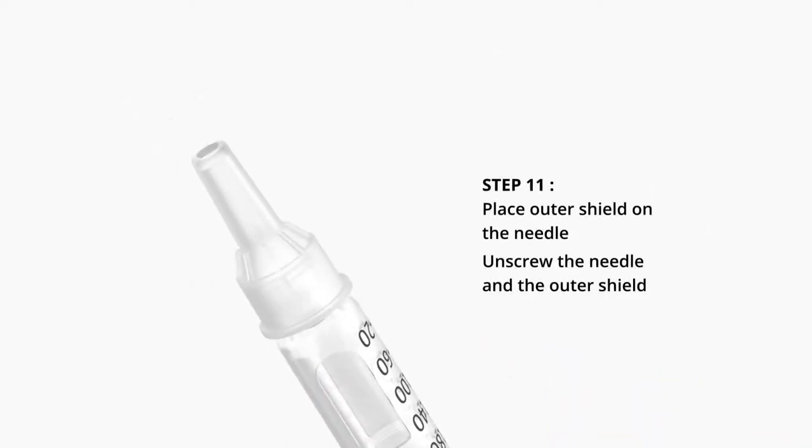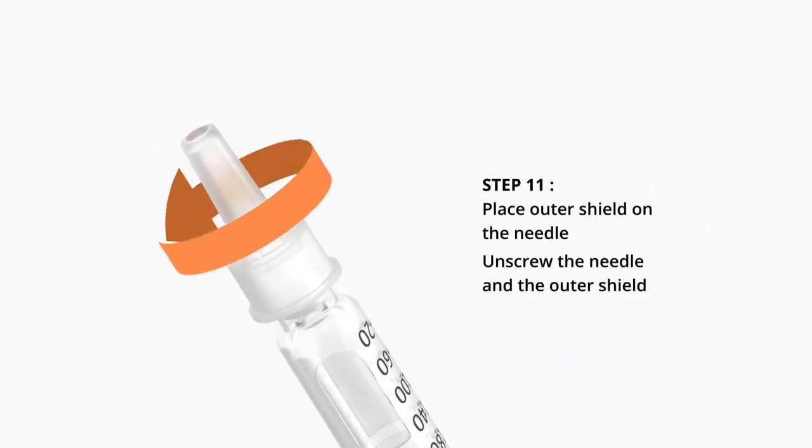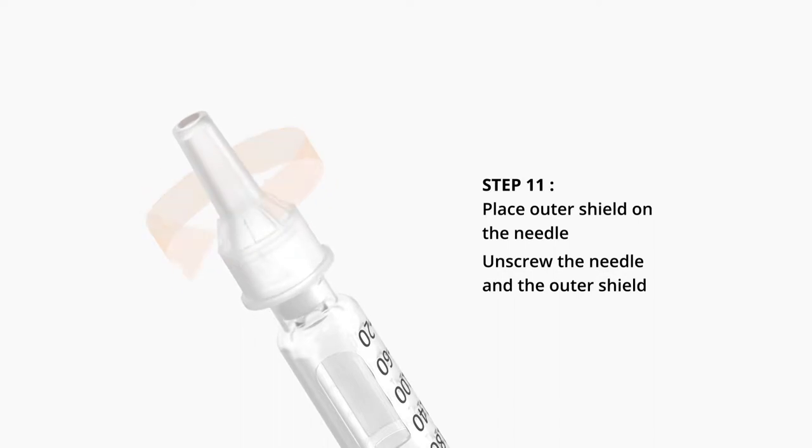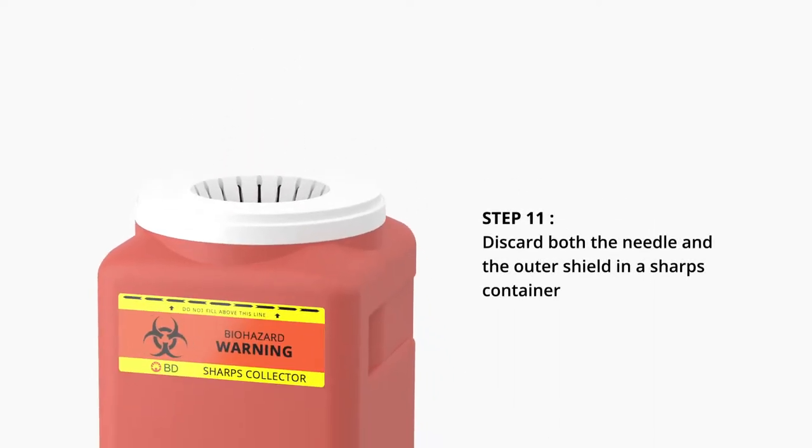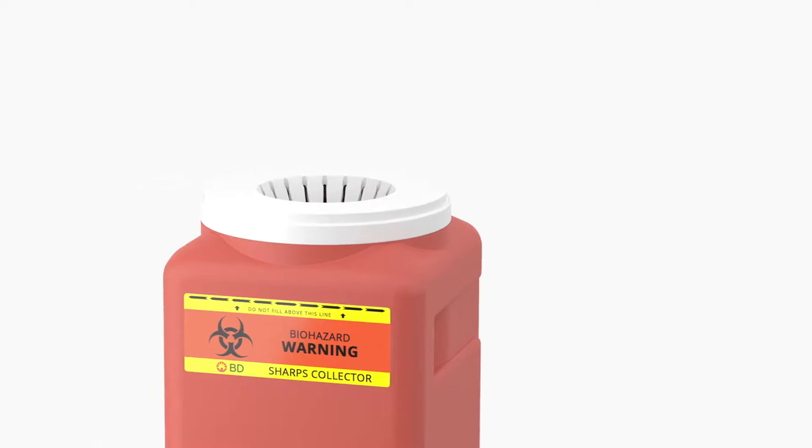Step 11. Place outer shield on the needle. Unscrew the needle and the outer shield. Discard both the needle and the outer shield in a sharps container.